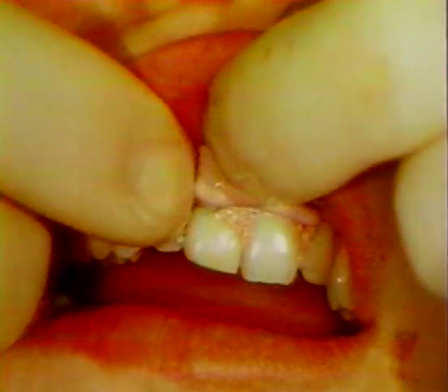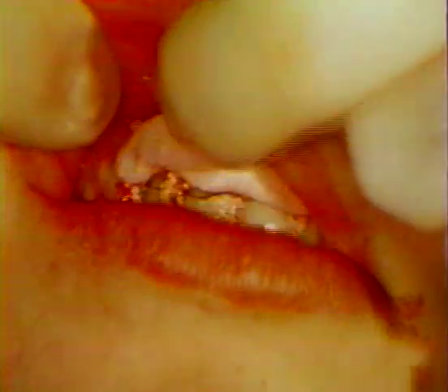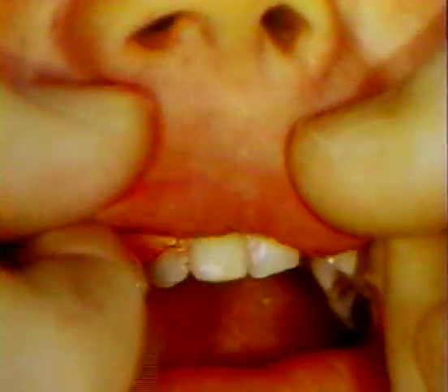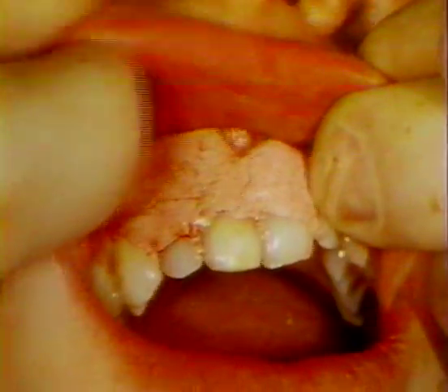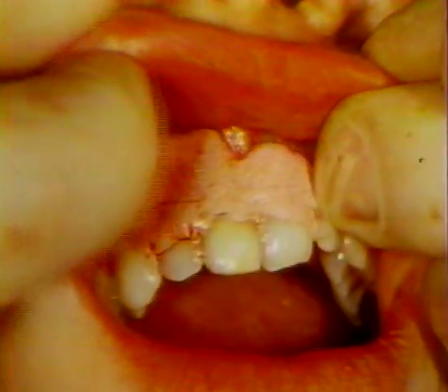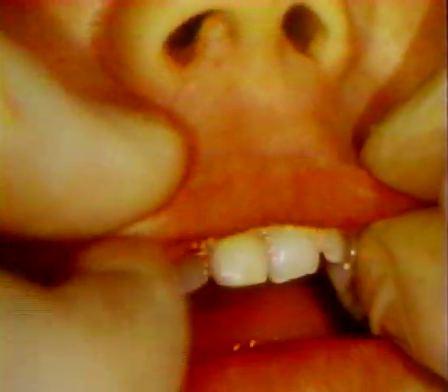A surgical dressing is placed over the entire area of surgery and extended to the neighboring teeth. The patient's lip is used to mold the dressing. The dressing must not interfere with the mucobuccal fold and labial frenum.